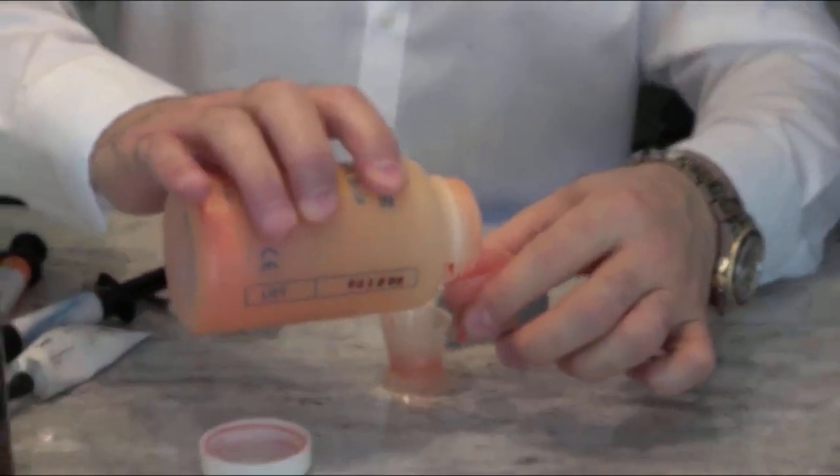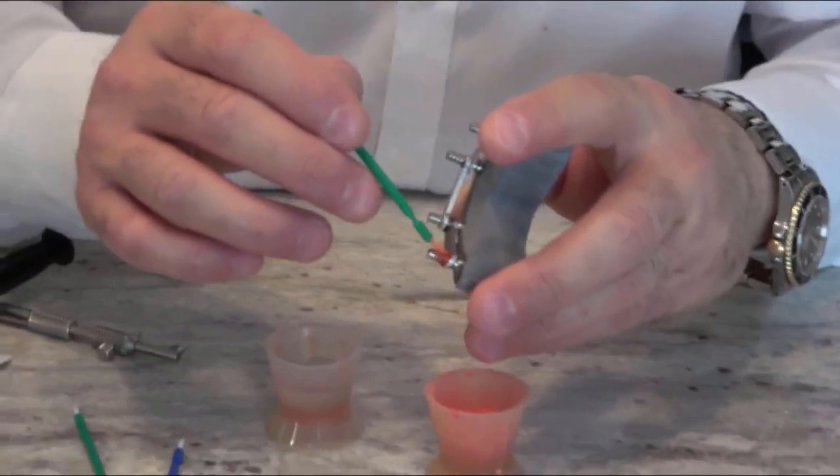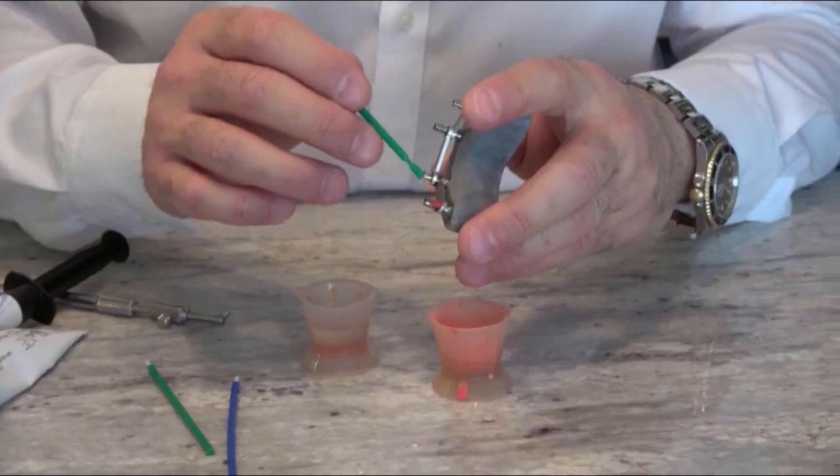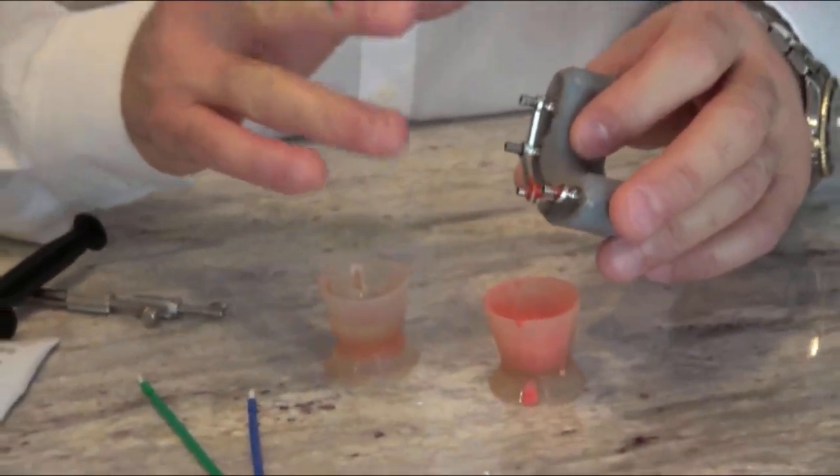Use the Duralay salt and pepper technique. Make sure it goes inside the grooves and connects the Easy Bar with the titanium cylinder. This has to be done in the mouth.